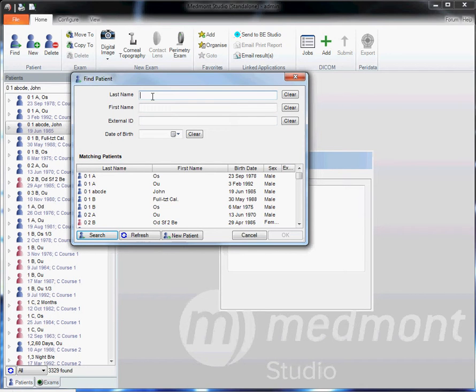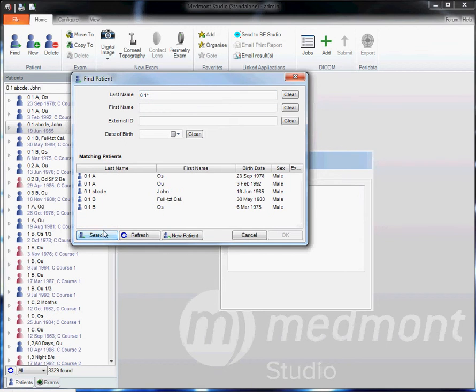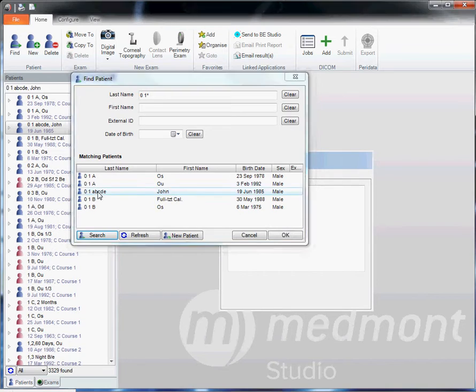Or if you only know the first few characters, enter in those characters followed by an asterisk and do a search. It will look for all the patients beginning with those specific characters.